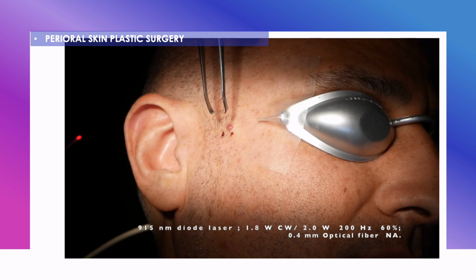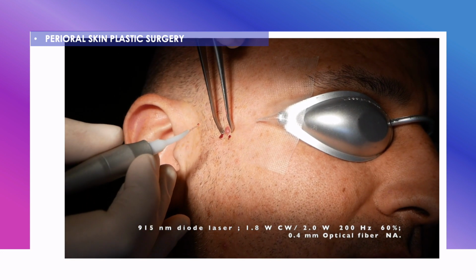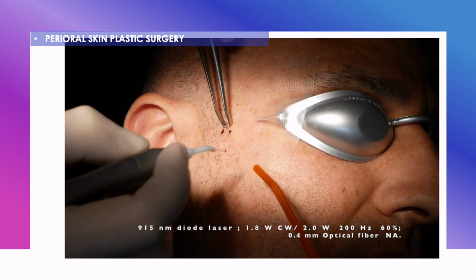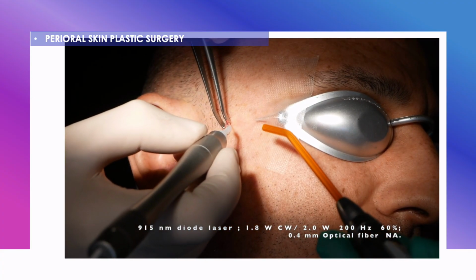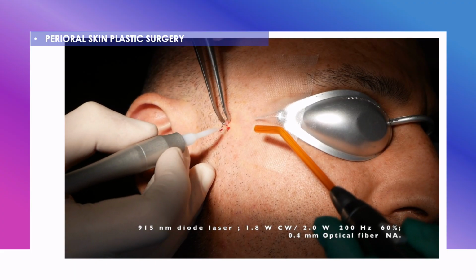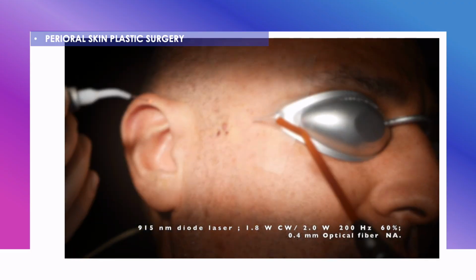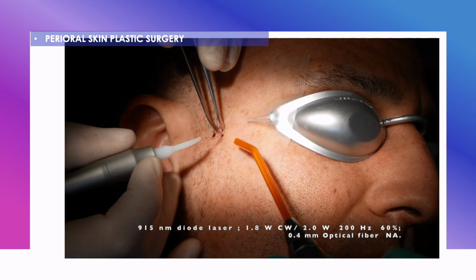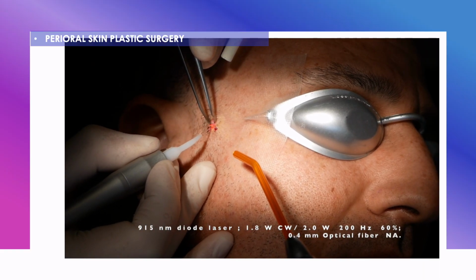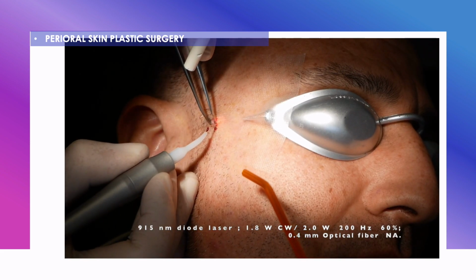This movie shows the surgical procedure, which is carried out using an optical fiber properly activated before the procedure. The diameter of the optical fiber used is 400 micrometers. The power used during the procedure ranges between 1.8 watts in continuous mode of emission to 2 watts in a pulsed mode of emission.